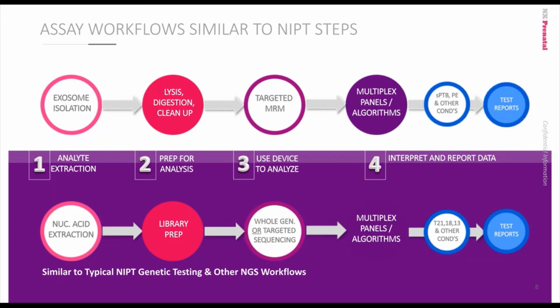The overall workflow, as seen here, is really not unlike, conceptually speaking, a typical genetic testing or next-gen sequencing workflow. In both cases, you have an isolation step of the content to be analyzed, a preparation step for analysis, and an analyzer for that content, and then the informatics software step and an interpretation and a report generated.